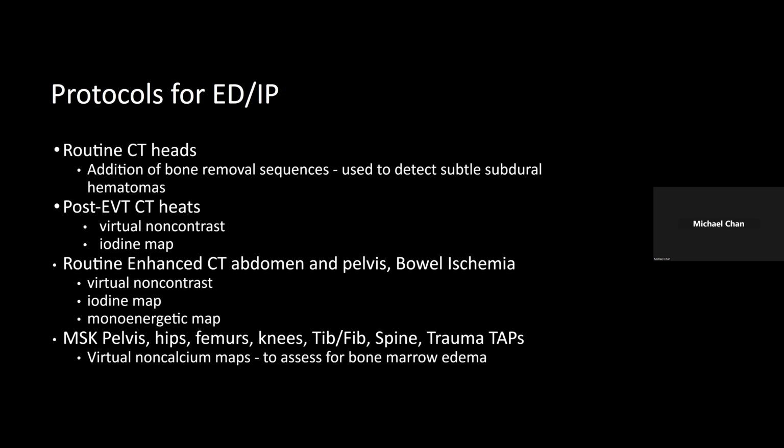But the protocols that we've been implementing have all really been for ED and inpatients. So as you all know, we've been implementing it on our routine CT heads in order to provide this bone removal sequence. And really, the number one reason to do this is to look for subtle subdural hematomas, which is often a question in our ED inpatient population, patients with falls, etc.